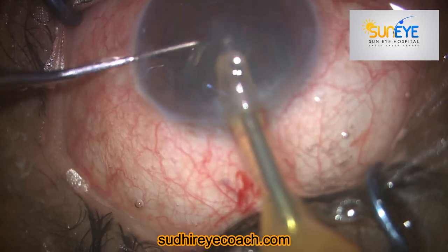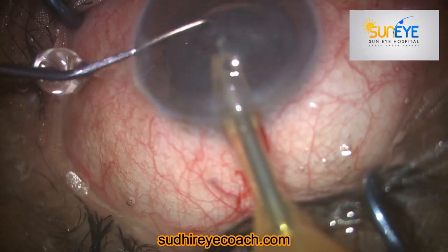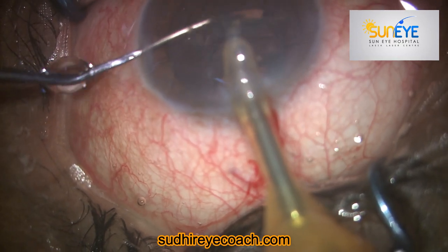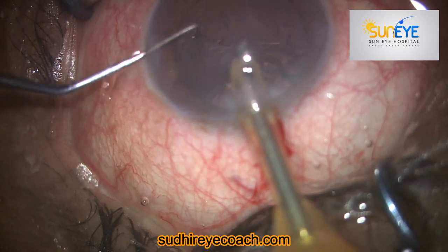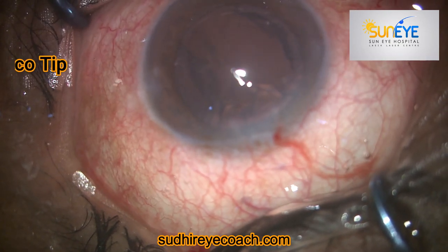Suddenly I realized there was a big vertical tear present on the posterior capsule. This was my first mistake — because on seeing it, I suddenly withdrew my instrument from the posterior capsule.